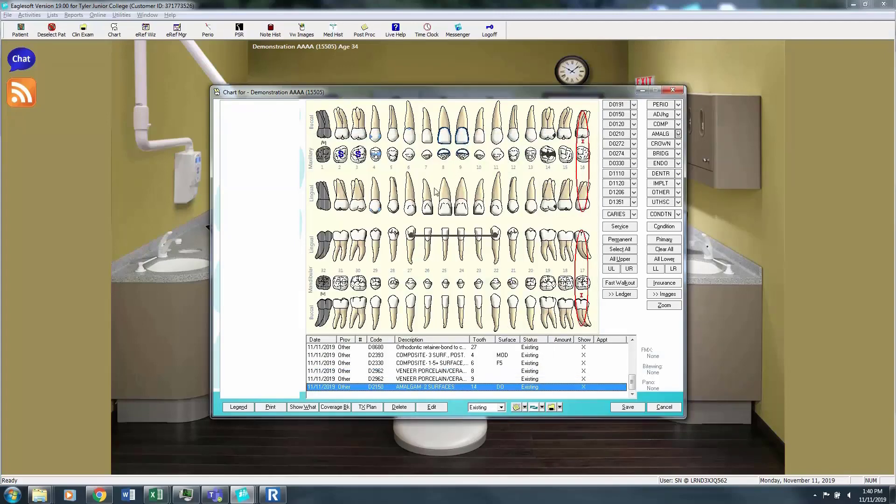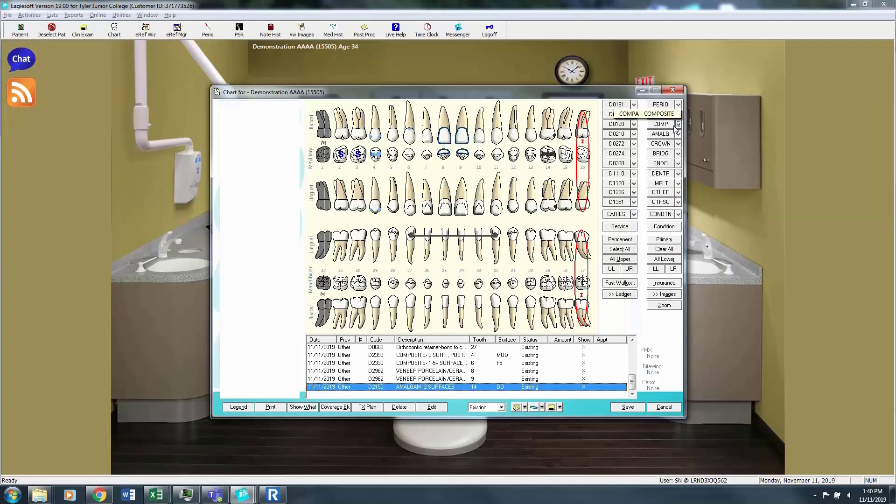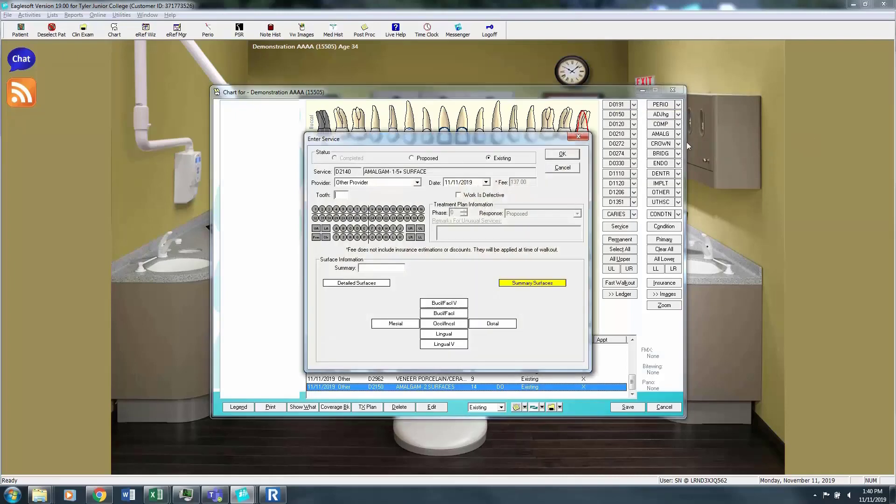So everything you need to chart the patient is going to be here on the right hand side for the most part. And use the drop down menu. Even when you're doing competencies, these drop down menus will populate exactly what you need to be selecting.